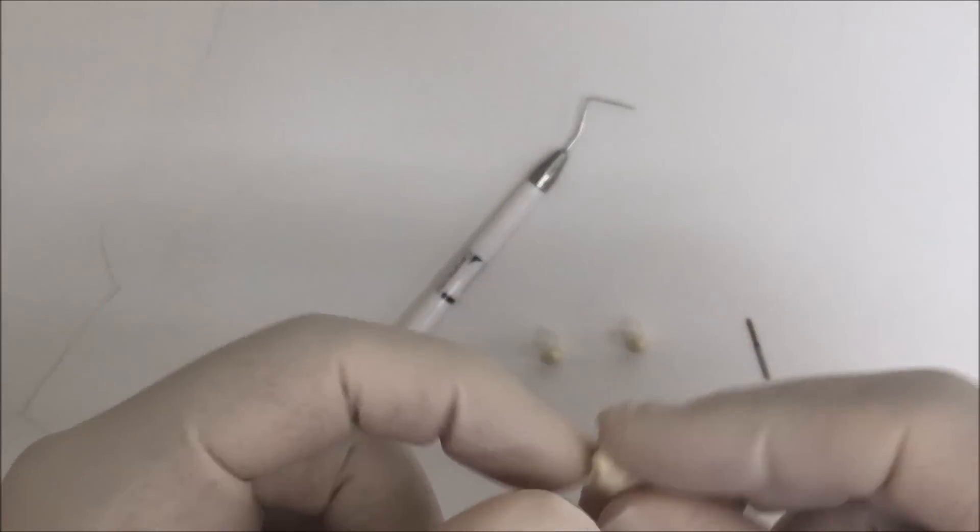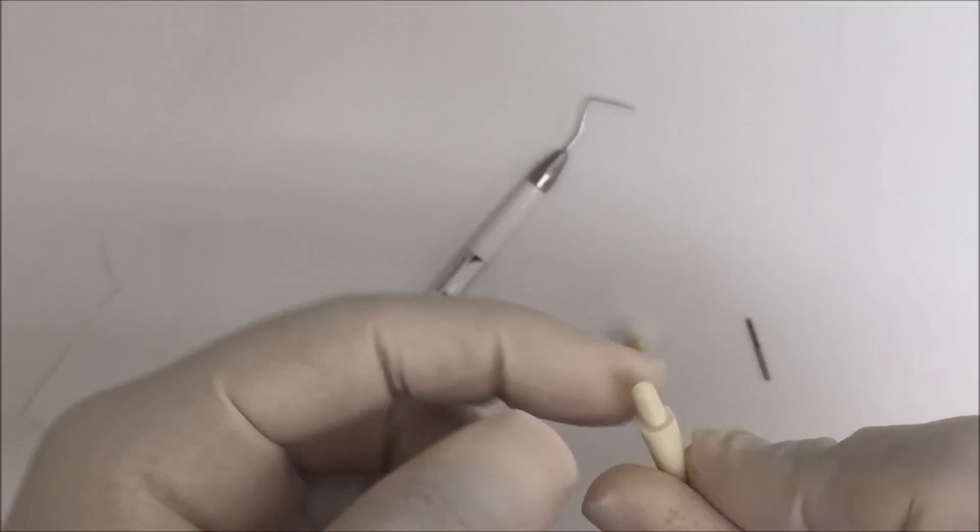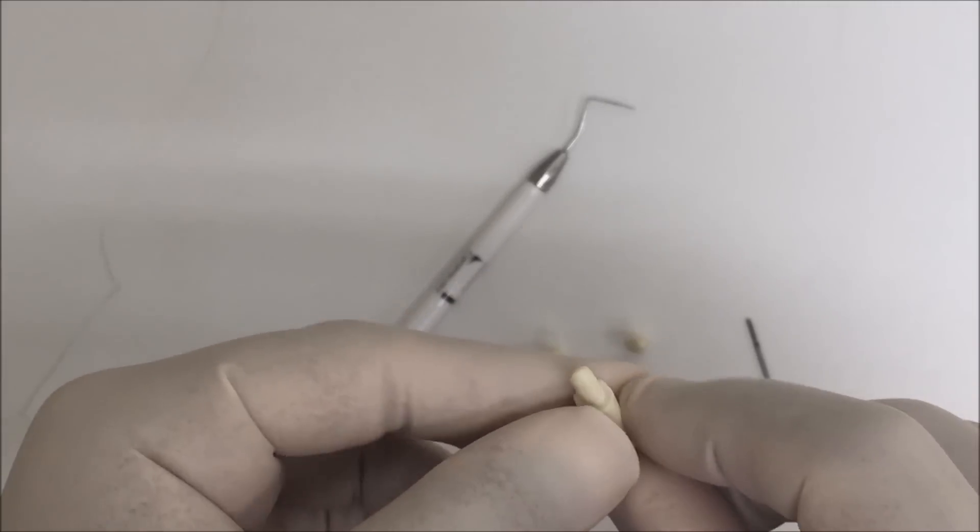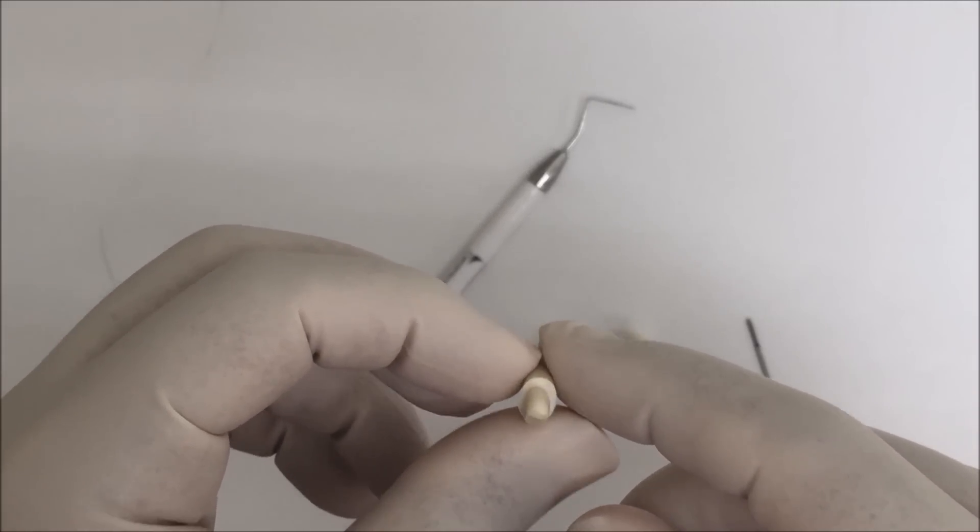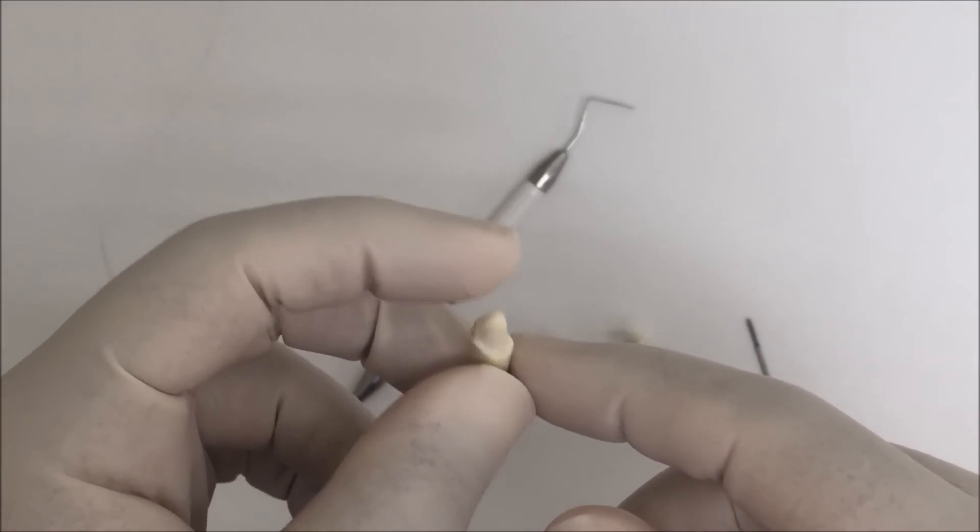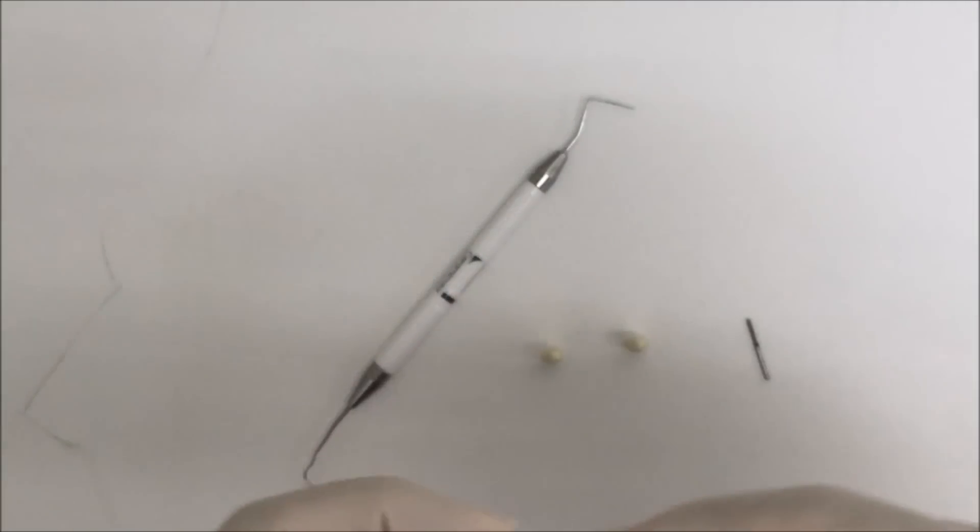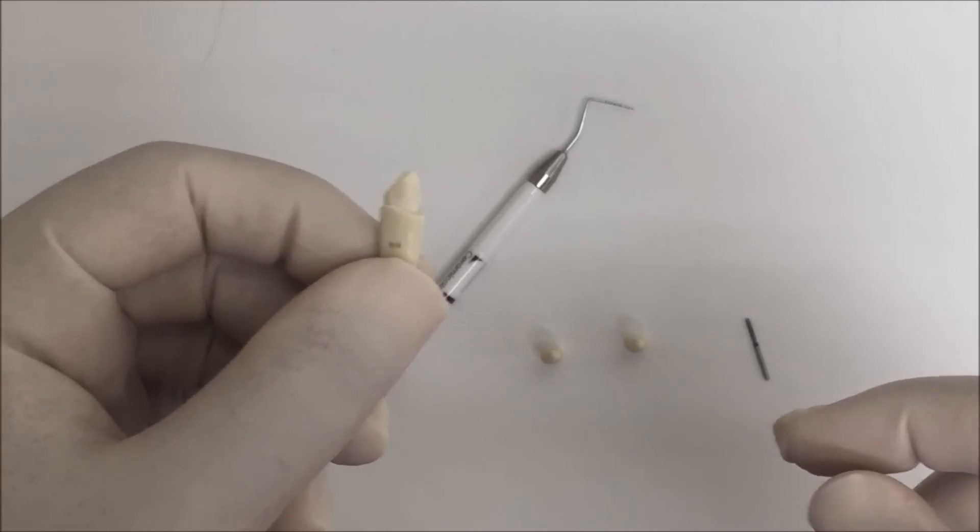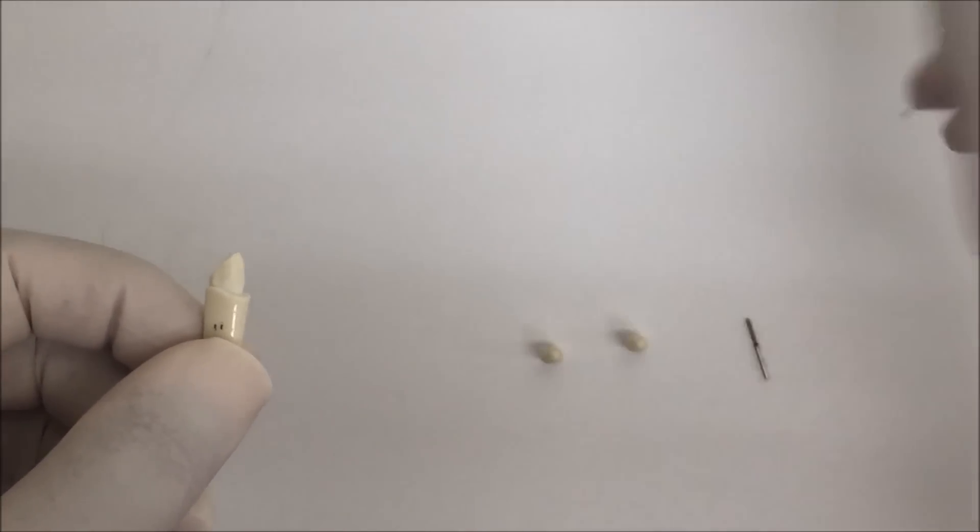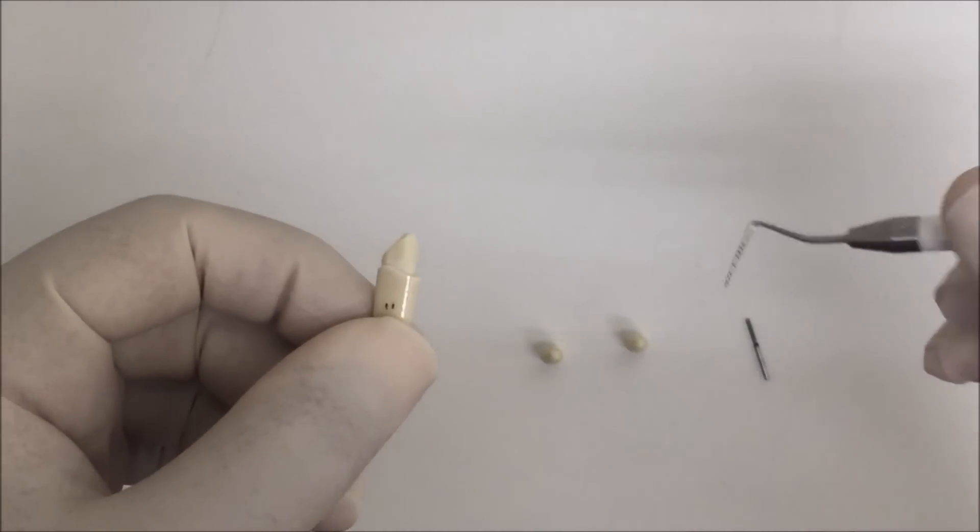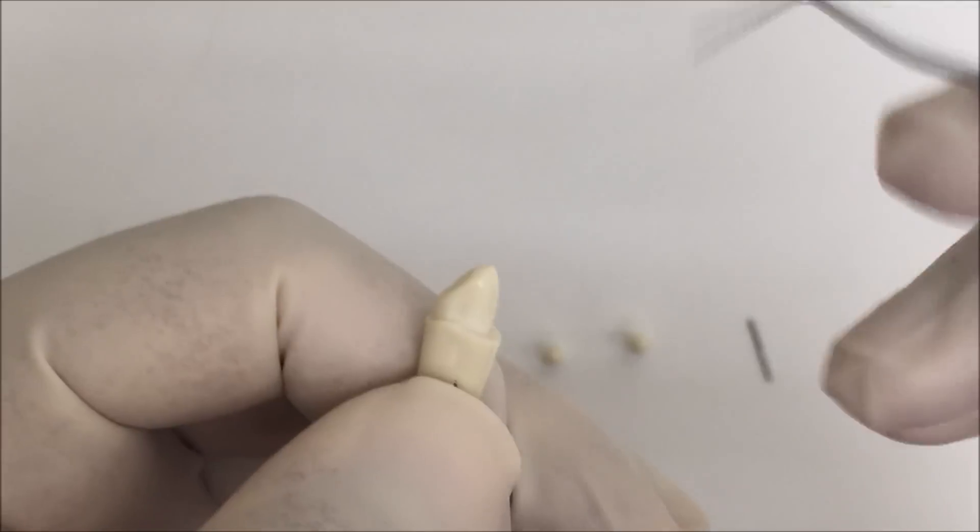I'm showing you today how to detect the presence of undercut in your preparation. There are three ways to check that. The first way is using an instrument or your bur by putting the instrument.